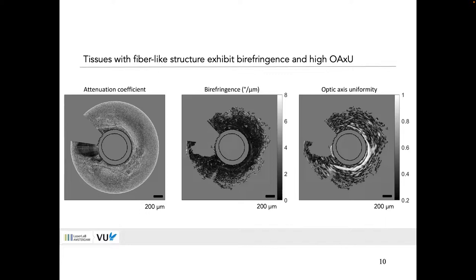And in this case, you know what it is. This is the muscle layer that is lying around the lumen of the lung. We're looking at the lumen of the lung that is about 2 millimeters in diameter, and around that lumen are muscles. Later we'll find out what the orientation of the muscle is, because we know the optic axis, so we can determine whether the muscle lies around it in a circumferential way, or lies along.